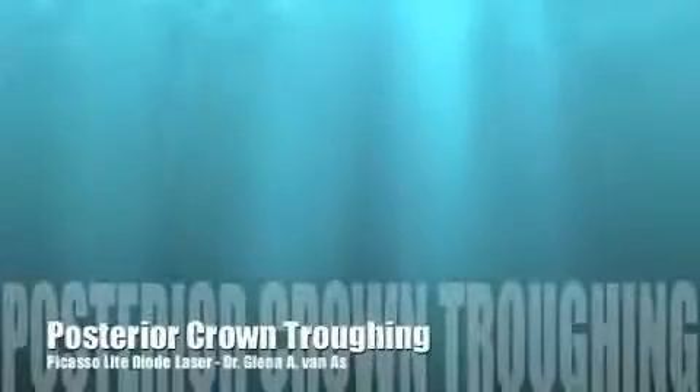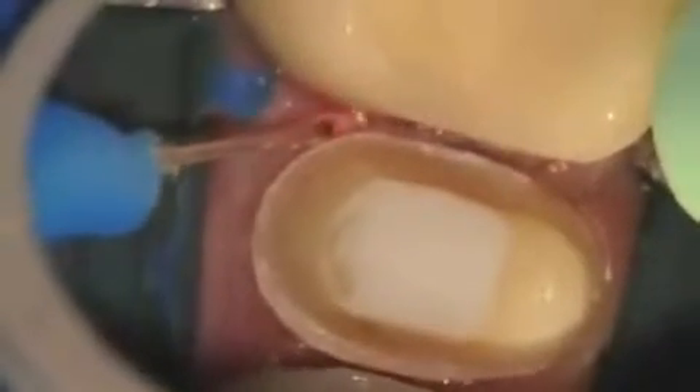Today we're going to talk about posterior crown troughing. We're going to look at an upper premolar that's been prepped for a porcelain crown. You can see the dial is brought in at 1.6 watts pulsed. Once you can see it initiating on the tissue, you're good to go.